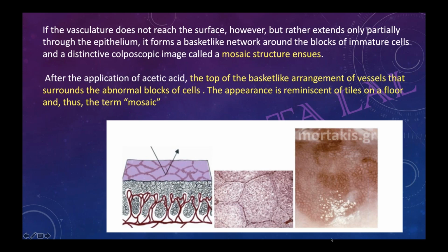In colposcopy terms we call this mosaic. Again it can be fine or coarse, but I'm not going into any details. You just have to know that terminology. If your role player asks in the exam, you should know what mosaic is, and then you'll be able to explain it.